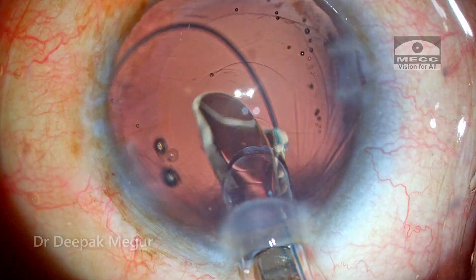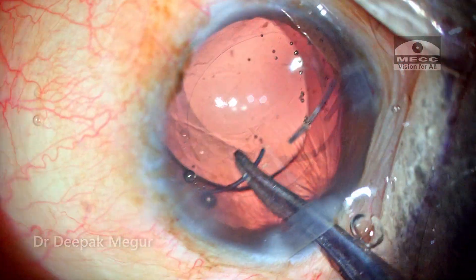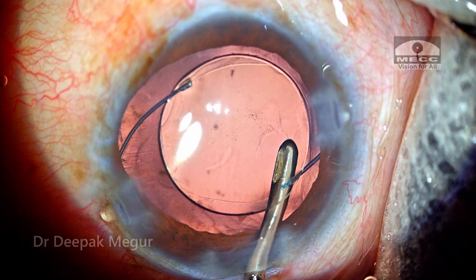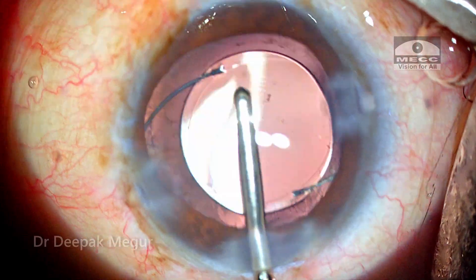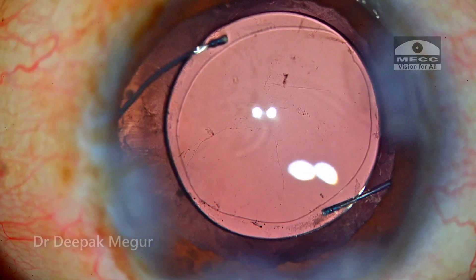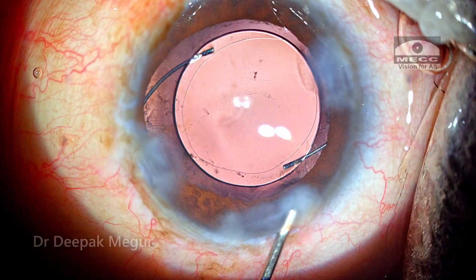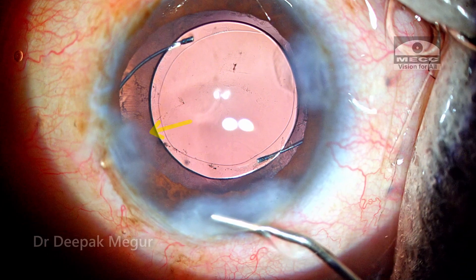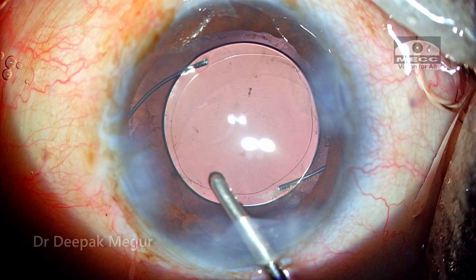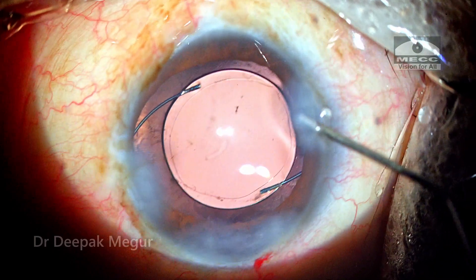The planned multi-piece intraocular lens is being placed into the bag. Time to remove the OVD — both in front and behind the lens is aspirated out. I'm ascertaining the centration of the lens; the lens seems very well centered and the rhexis is of appropriate size. Before closing I always like to confirm the absence of any prolapsed vitreous, because the pupil is abnormally wide in this area. I use diluted triamcinolone to confirm there is no vitreous prolapse. The incisions are hydrated and intracameral antibiotics are placed.